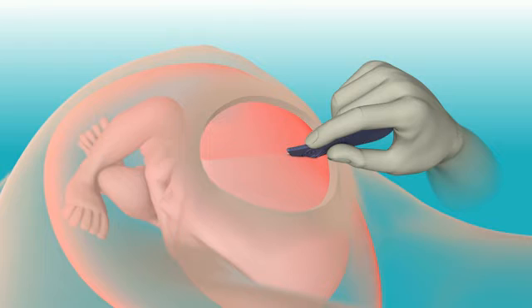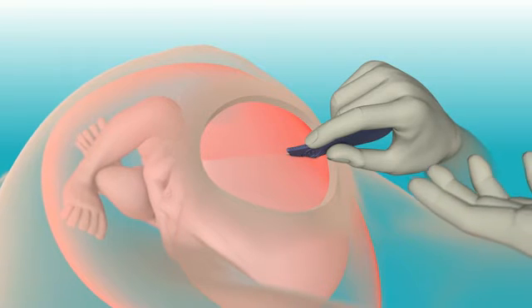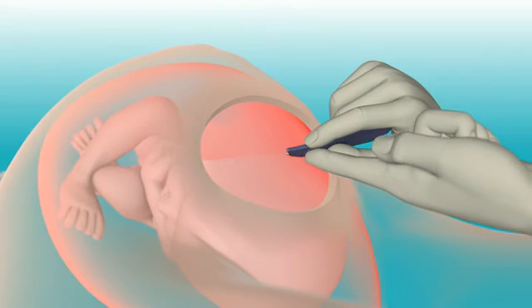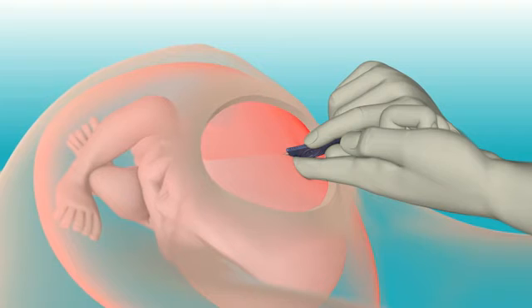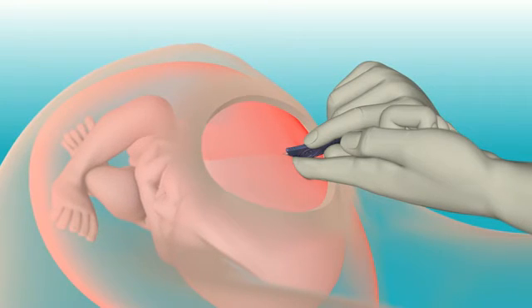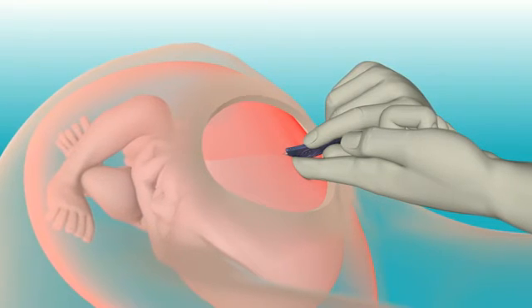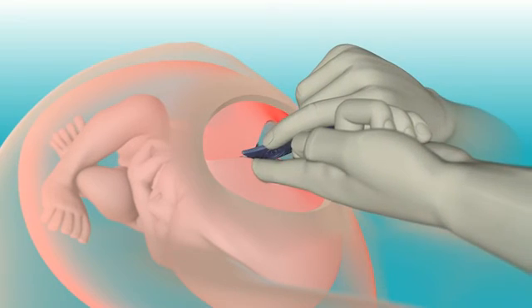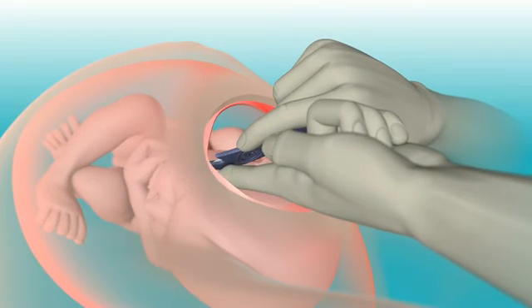For added safety, once the C-Safe enters the uterus, a finger can be placed under the device to prevent anything from coming in contact with the tip and blade. With your finger guiding the device, continue the incision transversely.